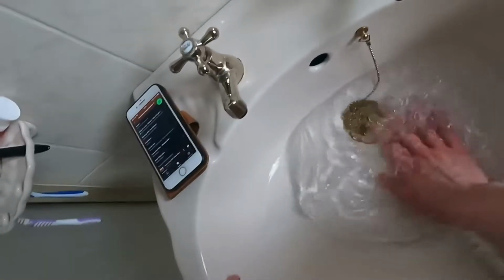Then get the blood flowing. So put your non-dominant hand in warm water for about 2 to 3 minutes. Then after that, it suggests doing jumping jacks or swinging your arm or clenching your fist for about a minute. I just did it for about 5 seconds, swinging my arm around. It just gets the blood flowing to your fingers. It suggests that you stand up for the whole process if you're able to.